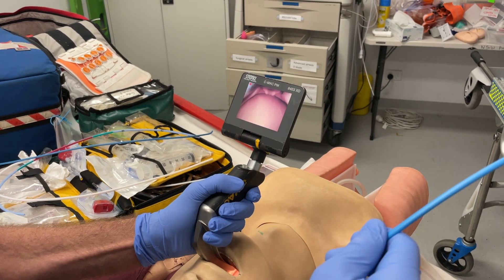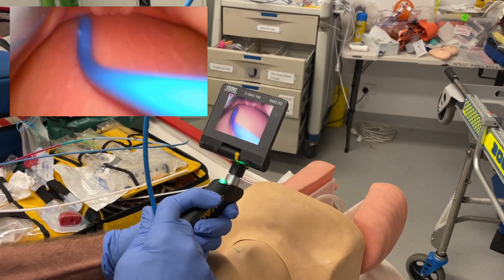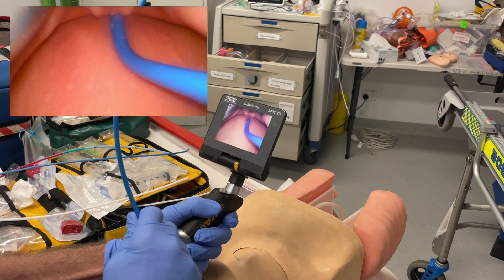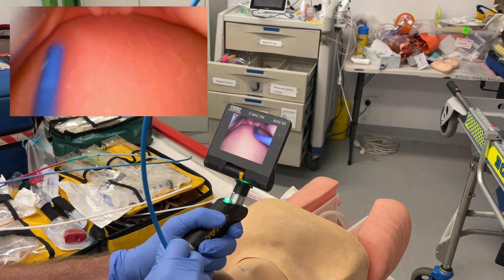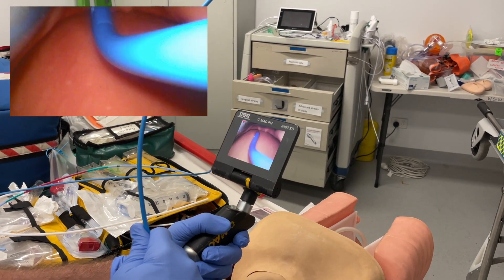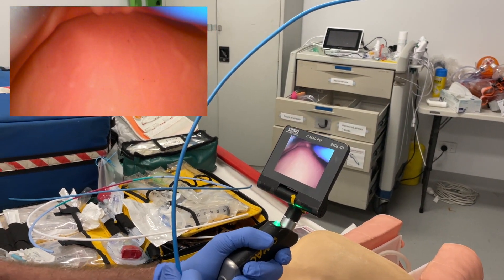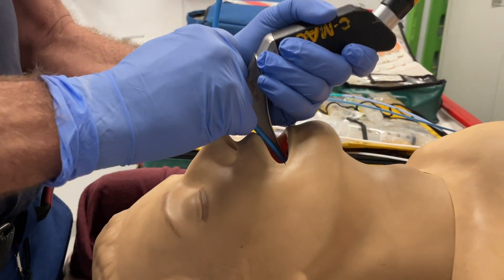I've simulated a very anterior looking view and if I just pass the bougie with no manipulation it's going to go into the esophagus. So I'm now going to do a scissoring maneuver between my middle and ring fingers to tilt that anteriorly. That's very easy to do with the throw over. That's the first micro skill.